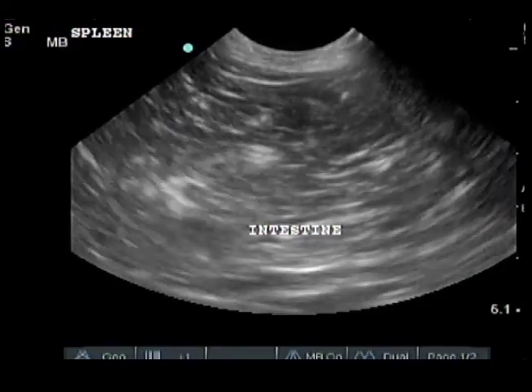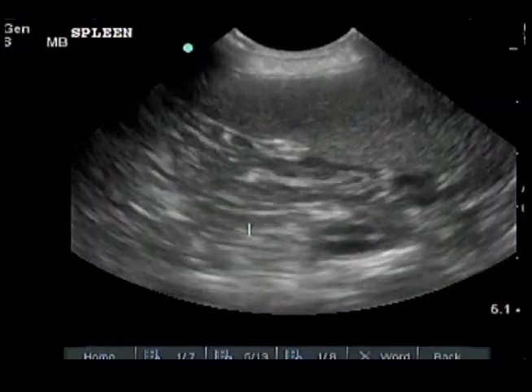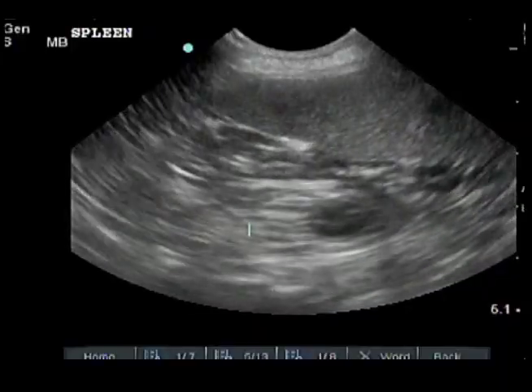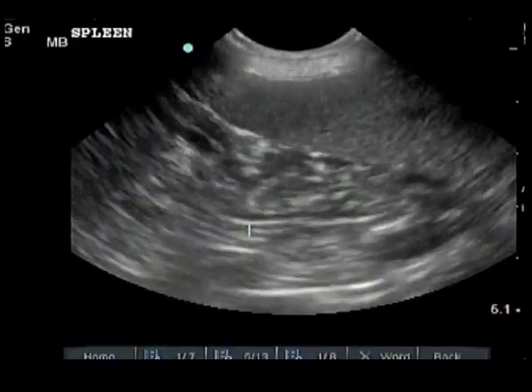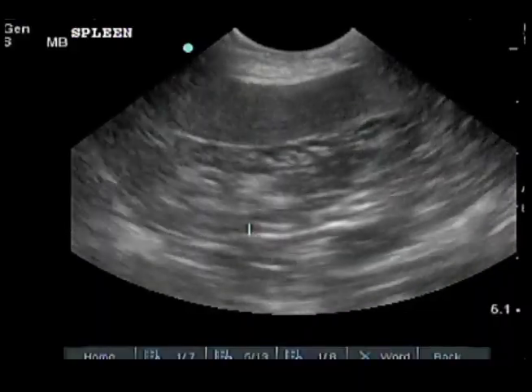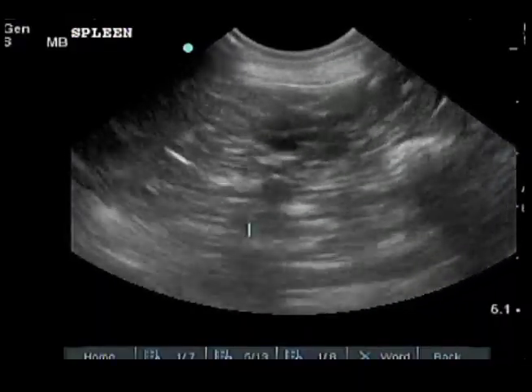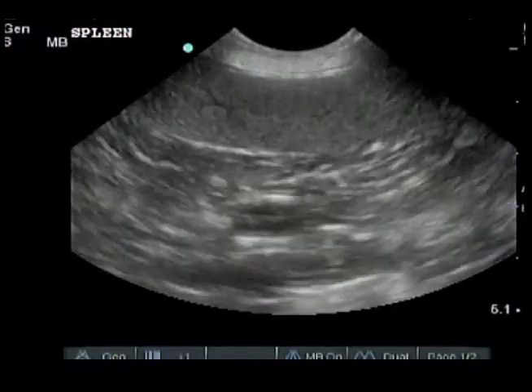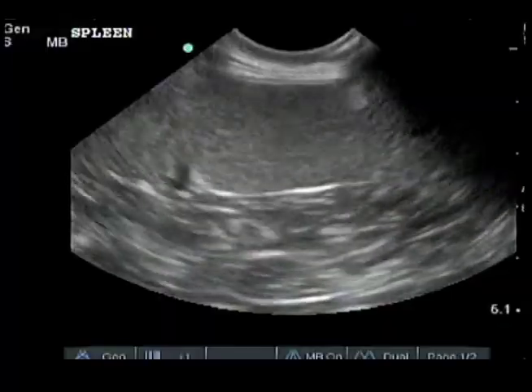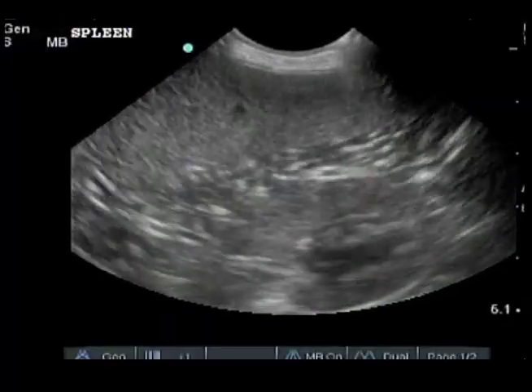Unfreeze the image and continue to follow the spleen. See how the tail of the spleen tapers down in size. When the spleen is gone, slide the transducer away from the transducer index. Then follow the short axis, spleen, from the tail back to the head of the spleen. This time we keep the trailing edge of the spleen to the right side of the ultrasound screen.